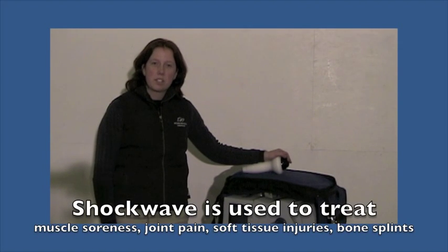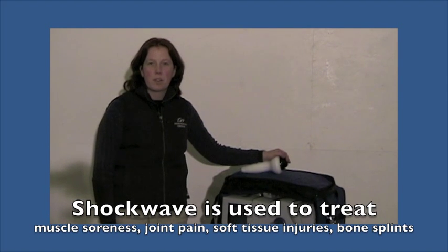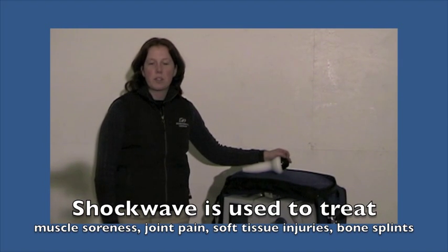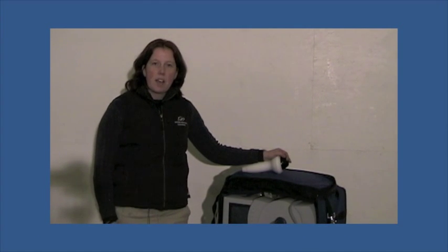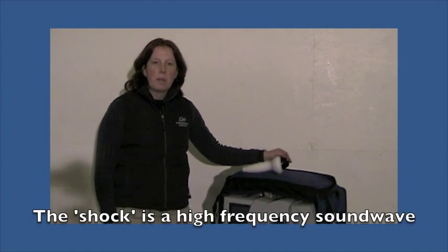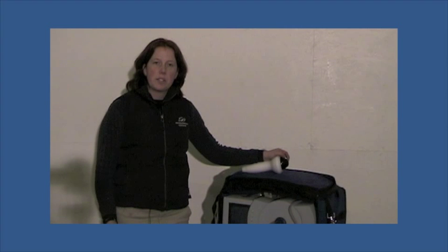Shockwave is used to treat a variety of different conditions, including pain and inflammation that can arise from muscles, joints, and also soft tissue. Essentially, what shockwave does is it emits a high-energy sound wave which penetrates into tissue, decreasing nerve stimulation on nerve ends, which helps decrease pain. It also increases healing factors from the body coming to the area, so it can help heal issues that are going on — essentially, it stimulates a biological response.